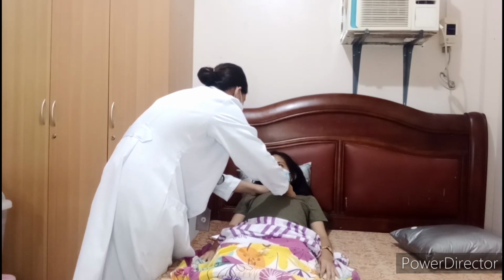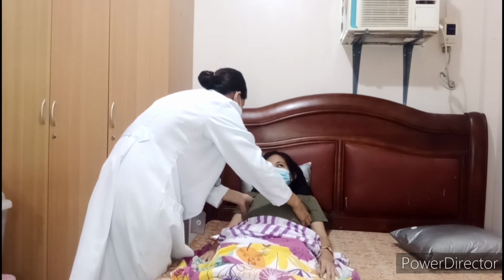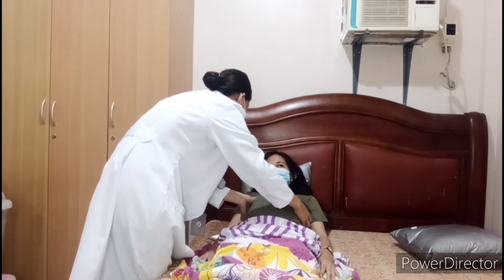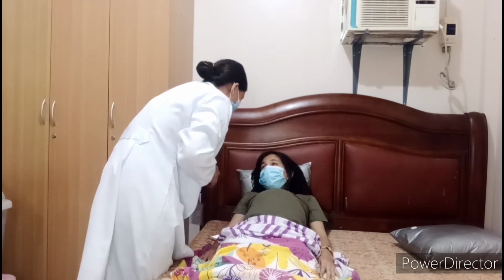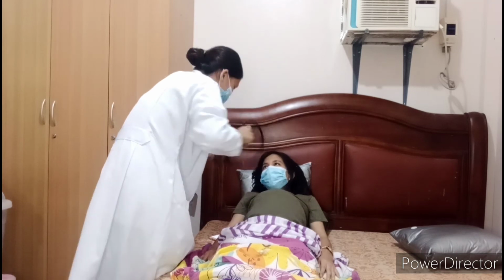To get the fetal heart tone, we are going to locate the fetal back by gently palpating on the mother's abdomen for a firm area. Then, perform the Leopold's number 2. So, for my patient, the fetal back is on the left side. Then, place the stethoscope and listen for 1 full minute.